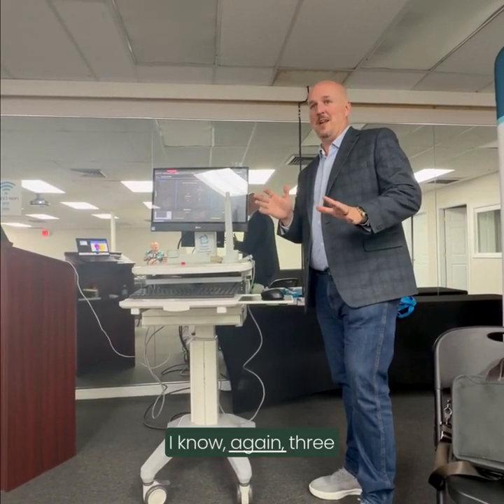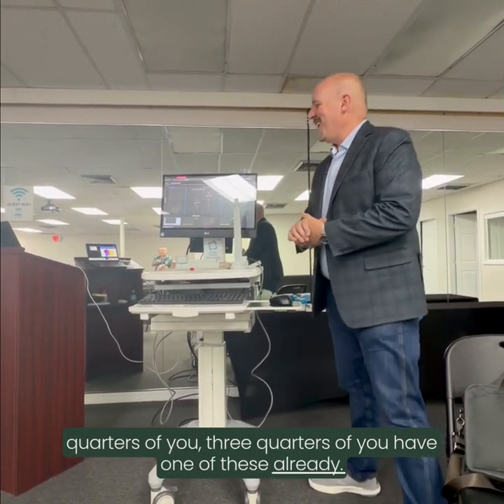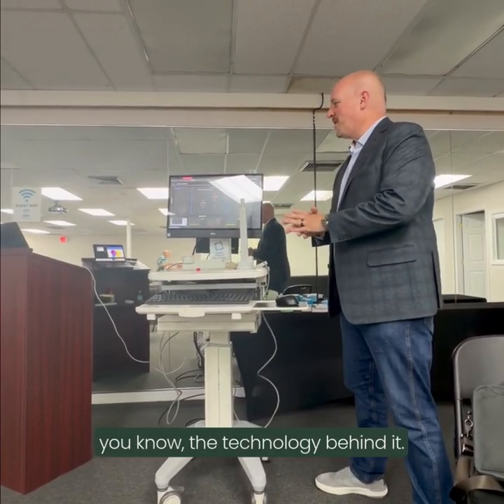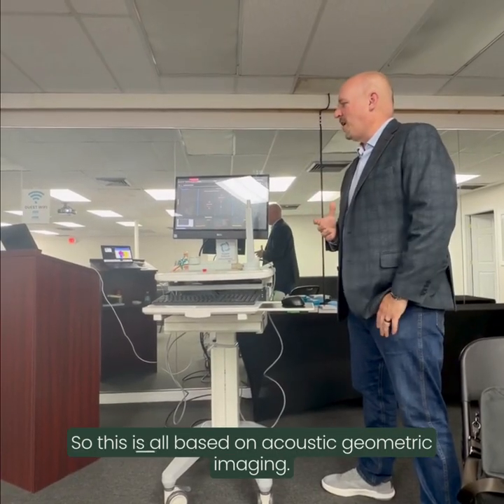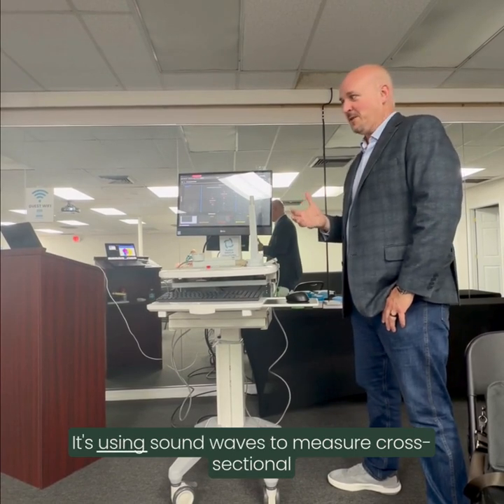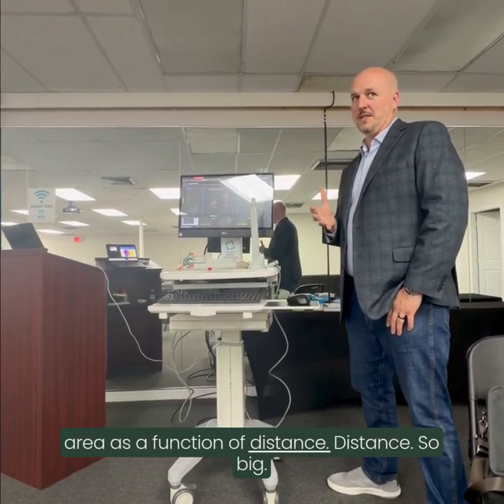Generally, I know three quarters of you have one of these already. But the basics on how the system works, the technology behind it. This is all based on acoustic geometric imaging. It's using sound waves to measure cross-sectional area as a function of distance.